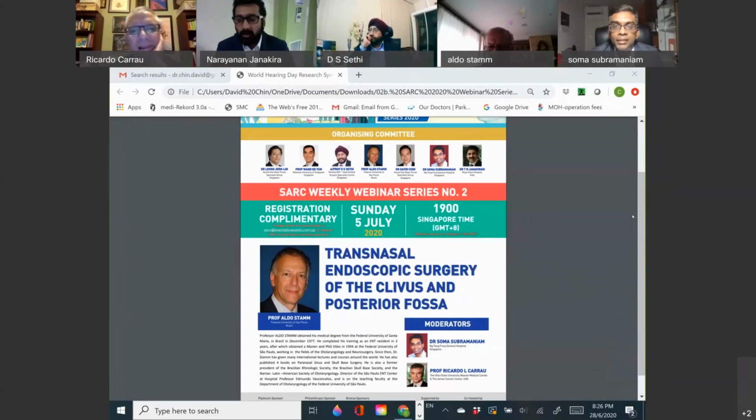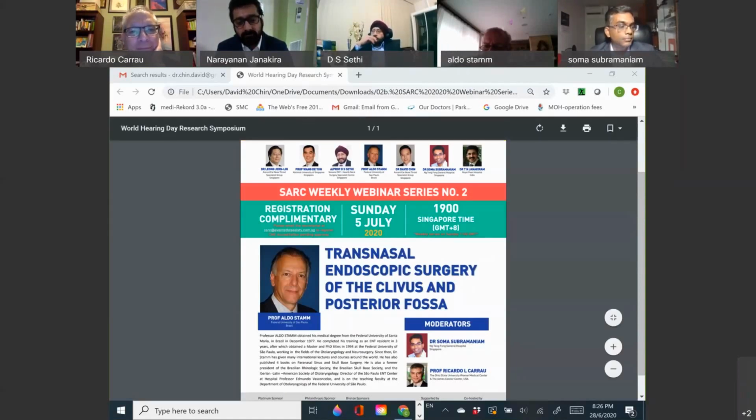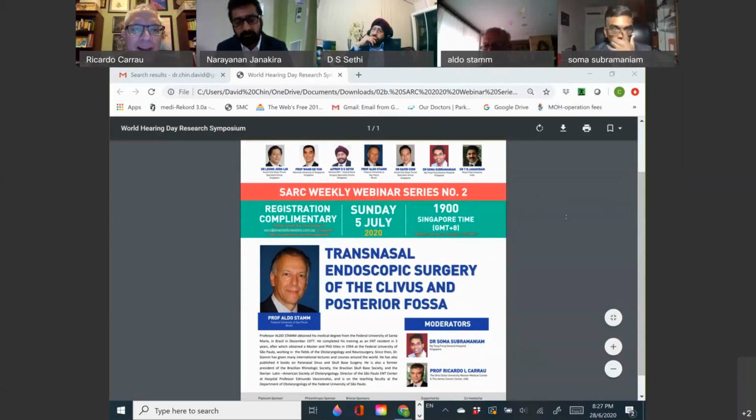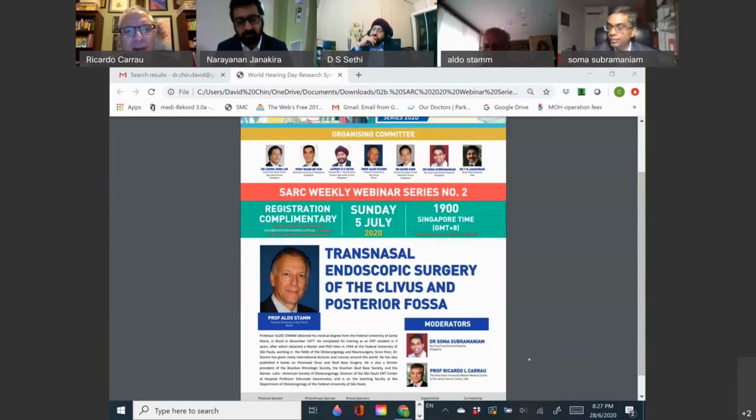Dr. Carrau first, if you don't mind. Yeah, so if you need that nasoseptal flap and you have a tear in the middle, we try to suture it. Or you can use some clips, or some other technique. If it is a small hole, you could also use a fat plug to repair it. But for the most part, you have to take care of it. Sometimes it depends on where the tear is. Sometimes the tear is not in the area of the paddle of the flap, and we just leave it alone. Or if we can move the tear to a place that is not going to be in the CSF, that would be fine. Another technique is to use a combination of grafts and flaps, and just leave the tear alone.